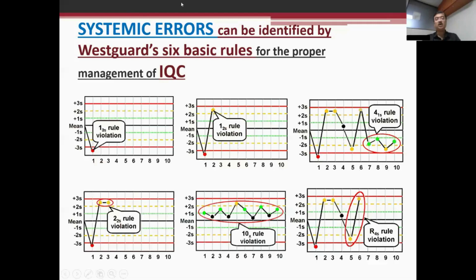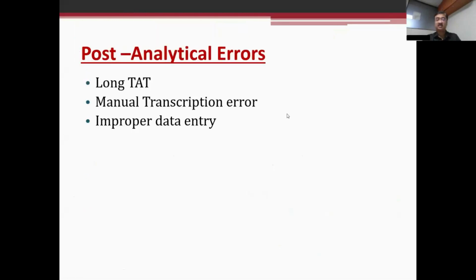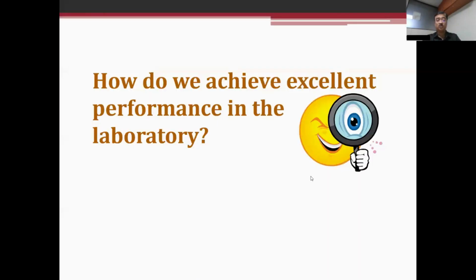Now if I go for post-analytical errors: long TAT, transcription error, improper data entry, delay in critical alert reporting. I have already told in detail what is meant by delay in critical alert reporting. Wrong interpretation of results is another very important thing which happens most of the time. How do we achieve excellent performance in the laboratory? There should be some corrective actions.